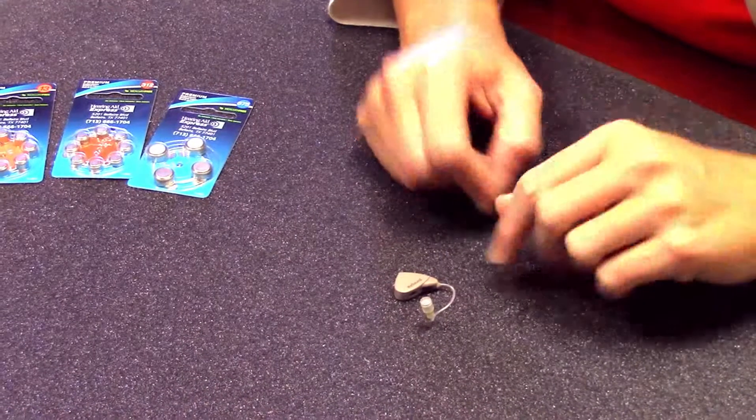Hi, today we're going to be showing you how to change batteries. I have for you a receiver in the ear, or receiver in the canal, hearing instrument, and we're going to change the battery in this particular instrument today. There are various different types of hearing aids and the way that you change the battery will vary depending on the style, but today we're going to do the receiver in the canal.